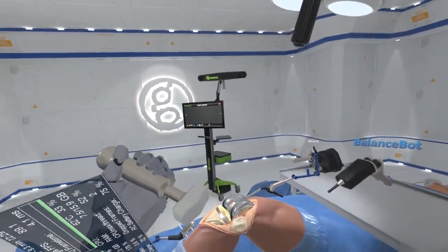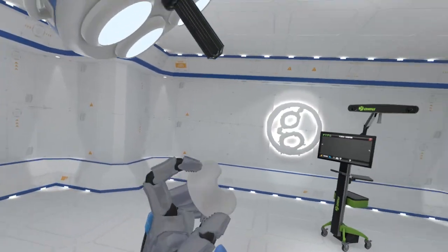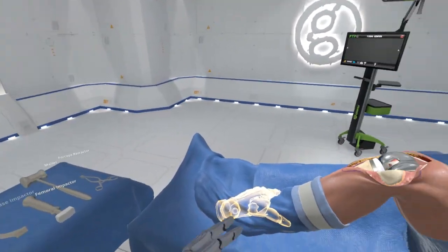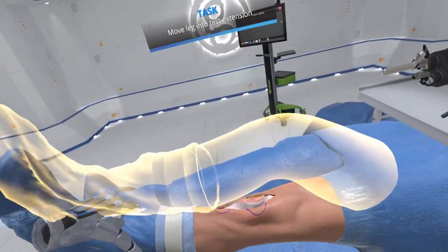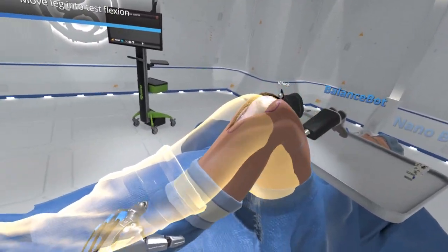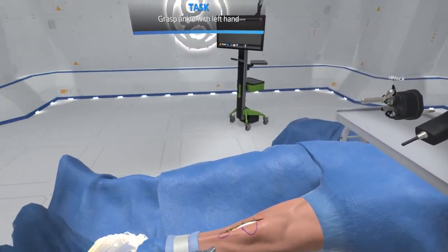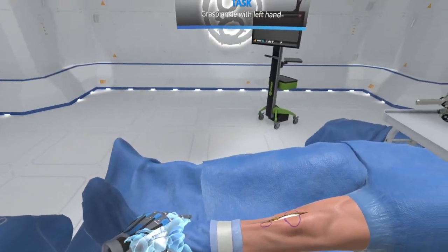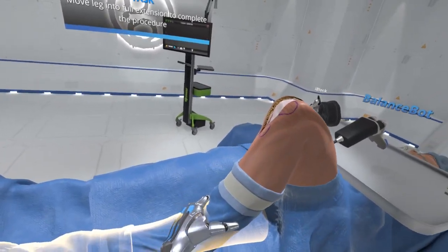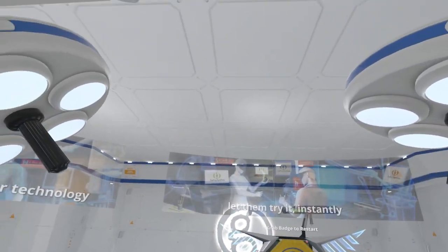Select the polyinlay. Insert the polyinlay into the tibial base. Now run the final range of motion test. Return the knee to 90 degrees of flexion on the surgical table. Congratulations, you have earned the total knee badge.